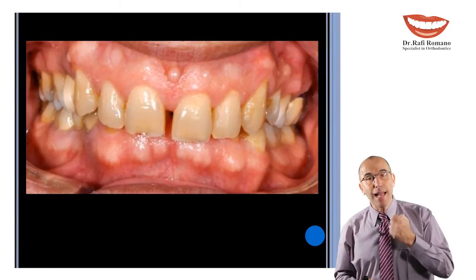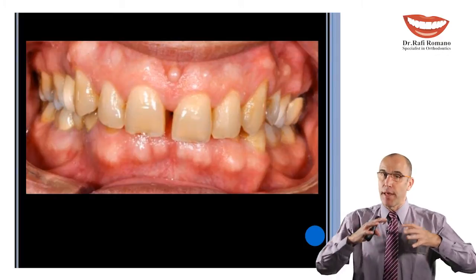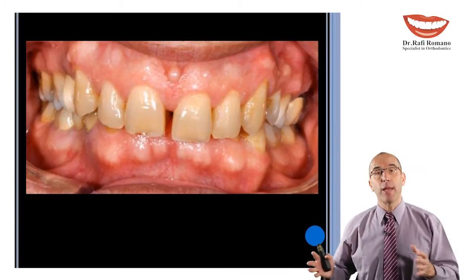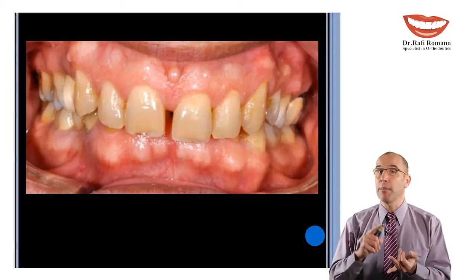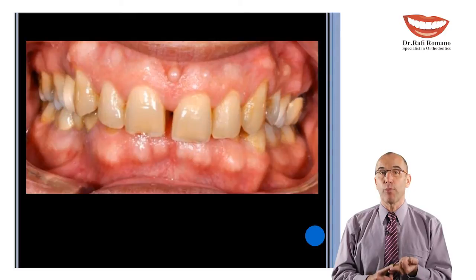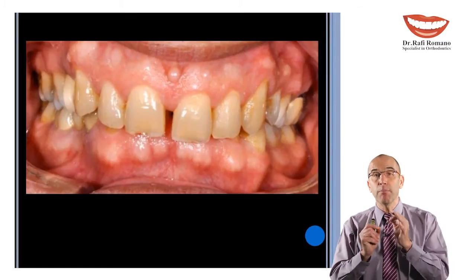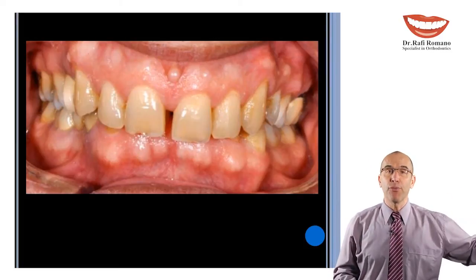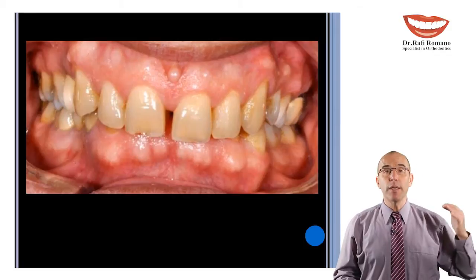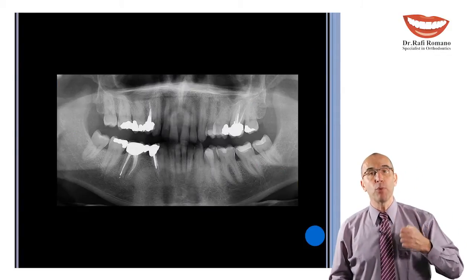Now, in an adult patient like him, do we plan to change the whole occlusion? And then we may go for CAD/CAM technology, maybe a 3D control bracket like the Evolution? Or do we plan to do a very minor alignment before he has some full mouth restoration? This is a very important question to be asked before putting the brackets.